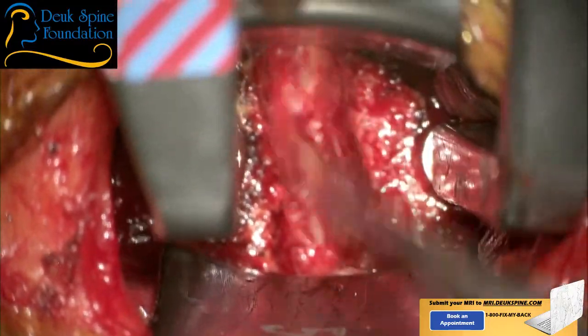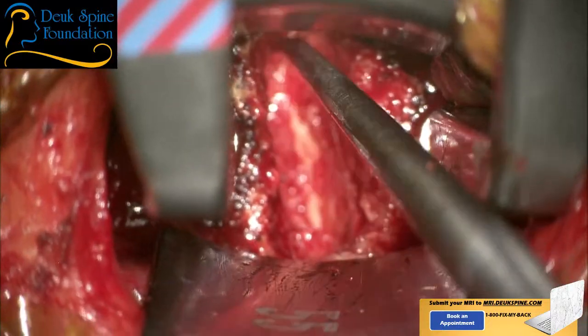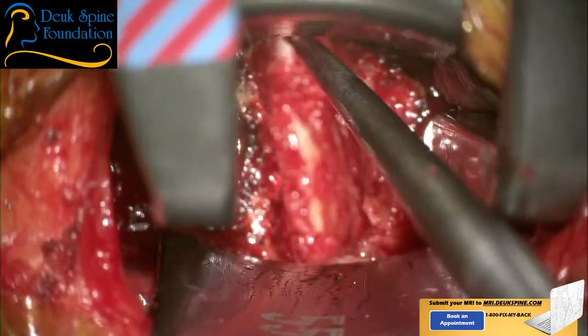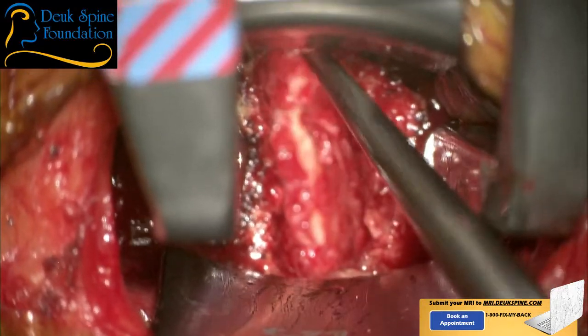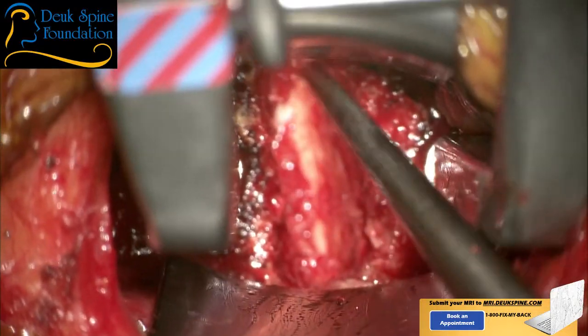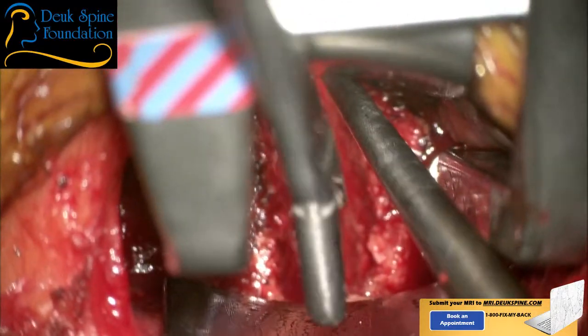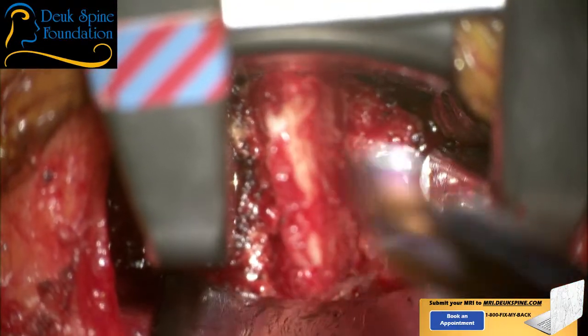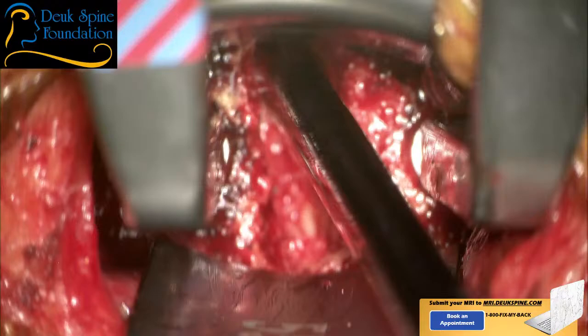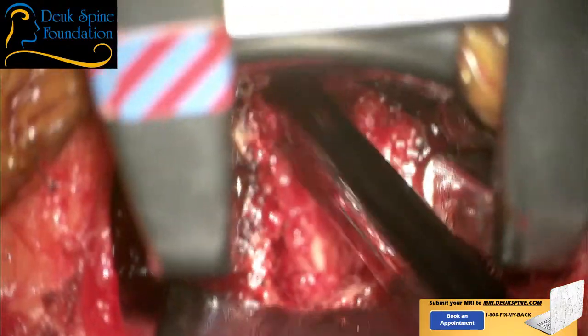So I'm still scraping out bits and pieces of disc. We're really right on top of the herniation at this point. We're going to have that in a minute. Get a pituitary, Dr. Patel. All right, Kerrison. Yep. This is a Kerrison, and it really grabs bone and ligaments and takes them out nicely.